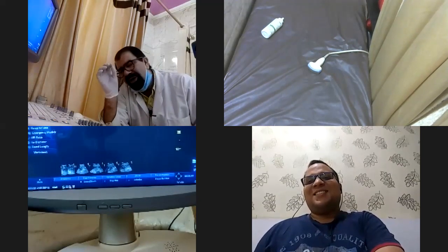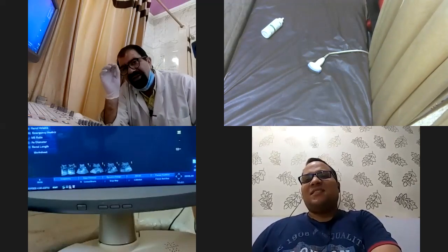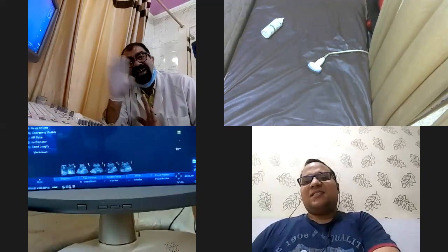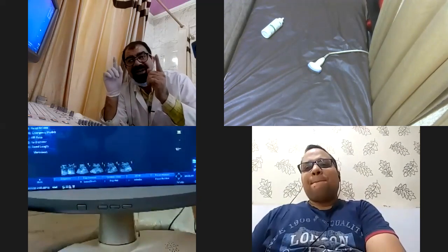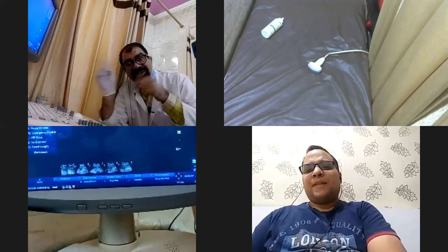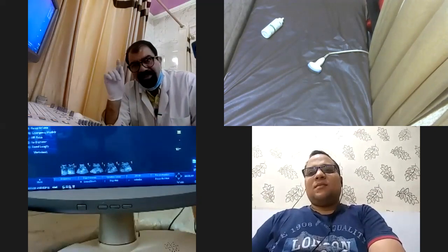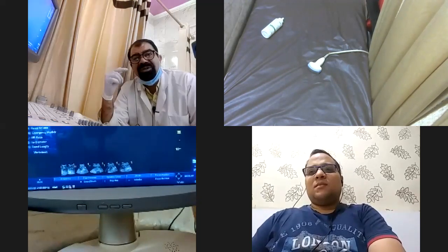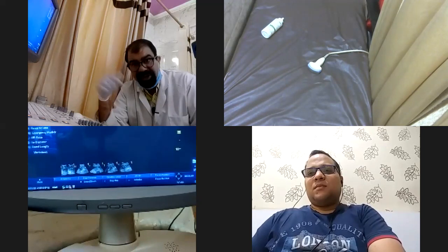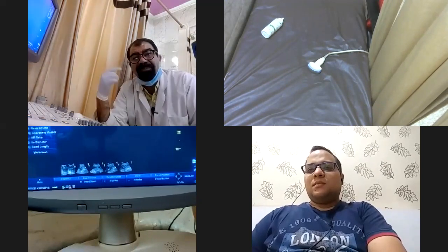Now see, the point is PRF is the pulse repetitive frequency, and the frequency, they are different. Don't think that there is frequency here and there, so they are same. No. Pulse repetitive frequency, the PRF, means the frequency by which the machine is sending the pulse.